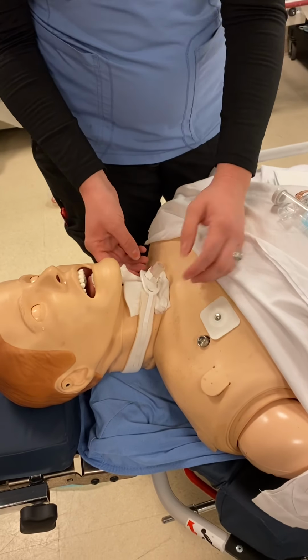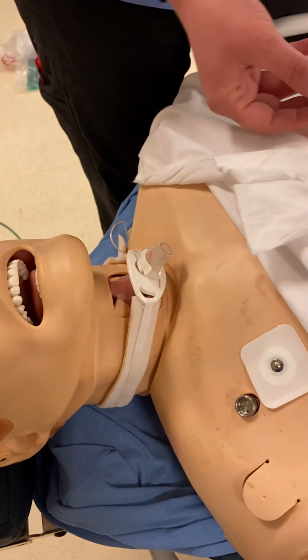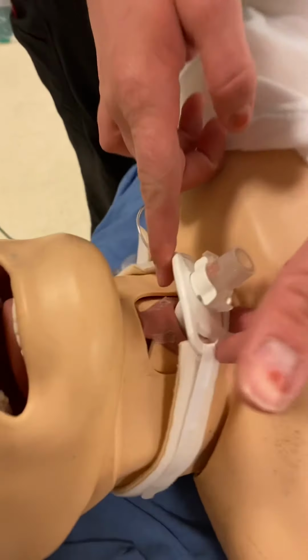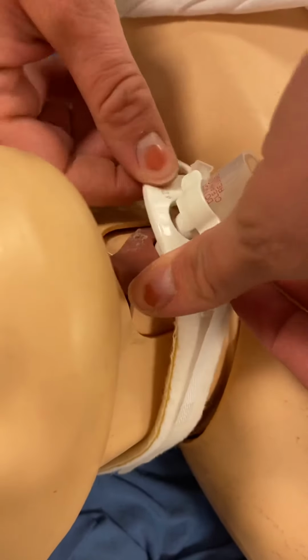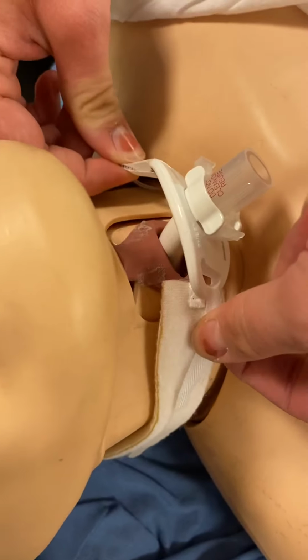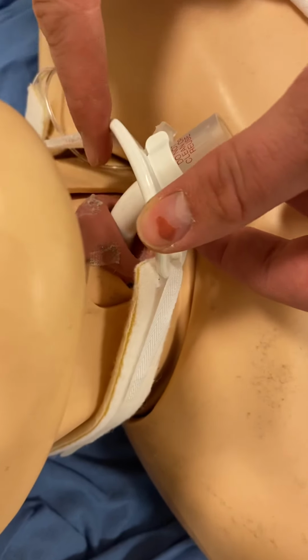Then I like to always take off my dressing. This is going to pull out any blood or secretions or gunk that gets built up around your stoma site here, and you want to visualize. And this is pretty pliable. As long as it's either sutured or secured with your trach ties, it shouldn't come out. So you can kind of lift and look, but you want to visualize this stoma.